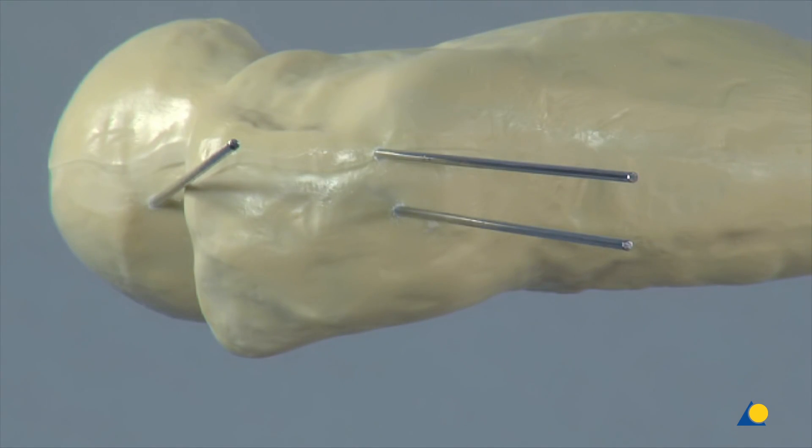In the AP plane, the second and third K-wires show the correction angle of 30 degrees relative to the first K-wire.